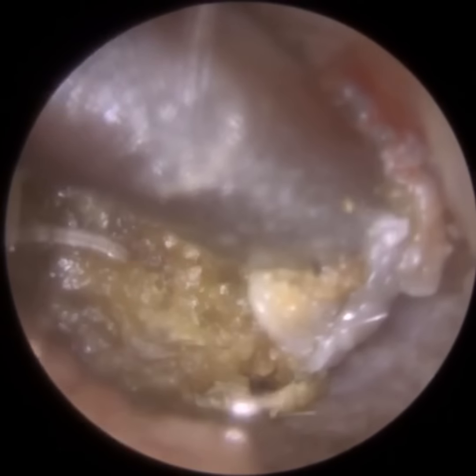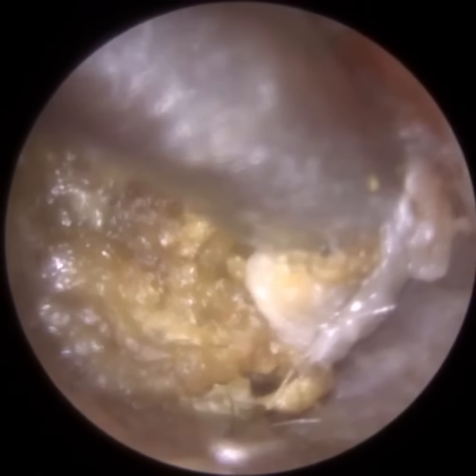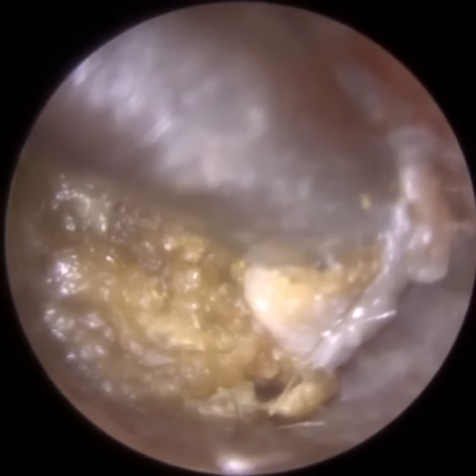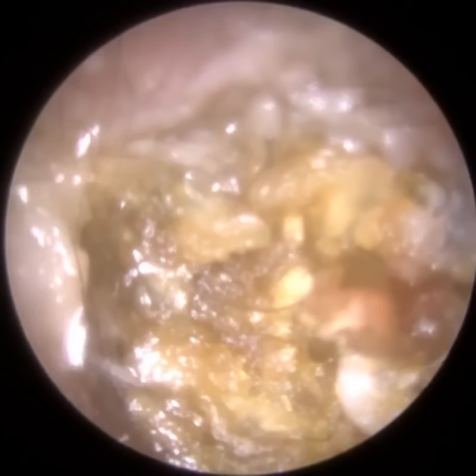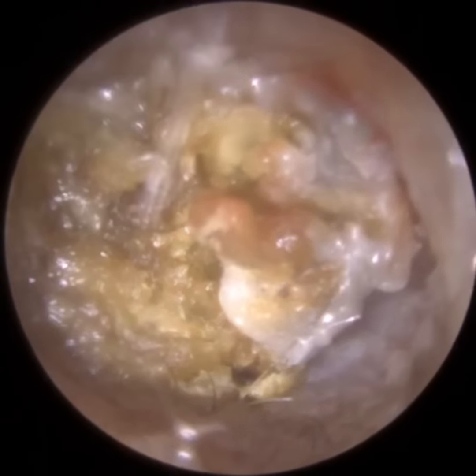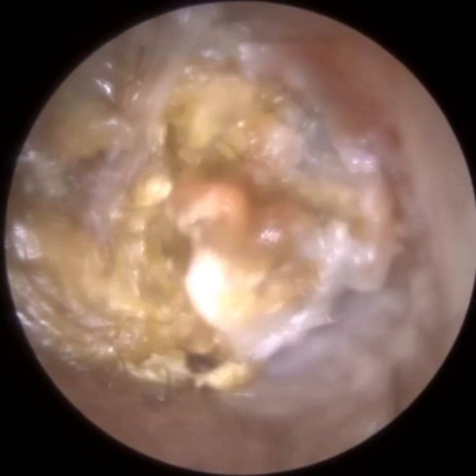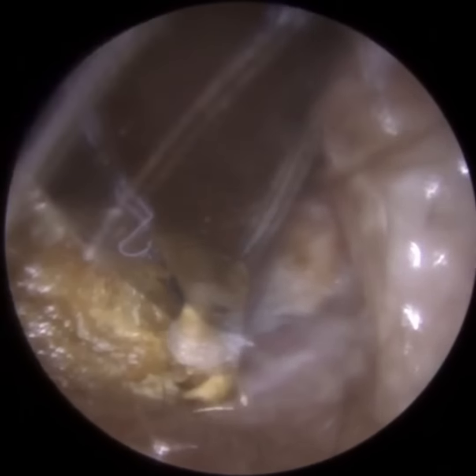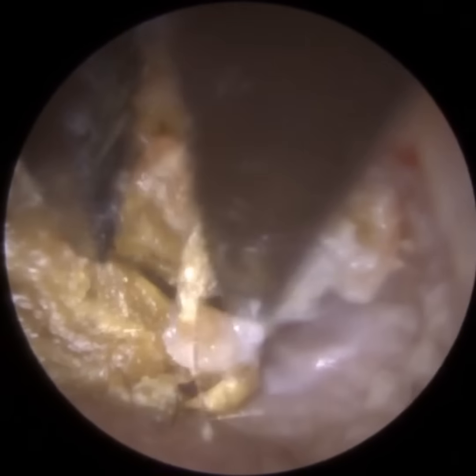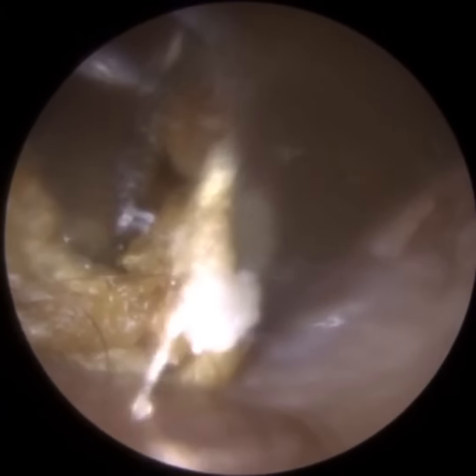You've got some really strong skin adhesions here that are attached to the ear canal. And here's that contact bleeding just here on the right hand side. So the plug is expanded so much, it's widening the bony part of the ear canal, it's compressing against it. If you watch my YouTube channel, there's a playlist of other cases of keratosis obturans. In comparison, keratosis obturans is always complicated to remove, but I've had far more complex cases than this.